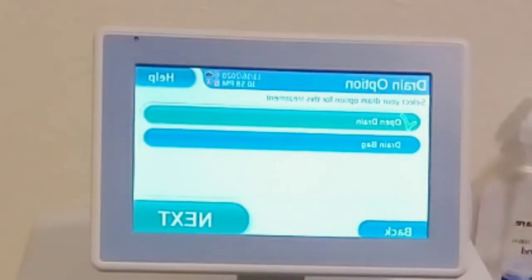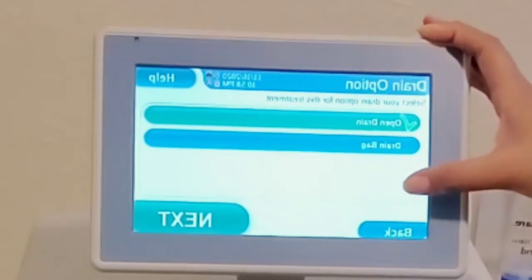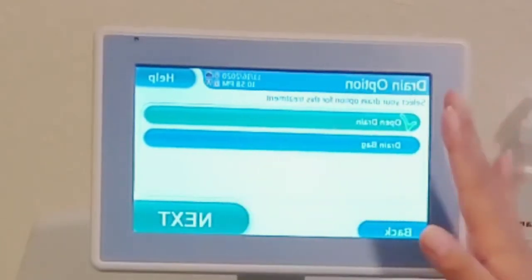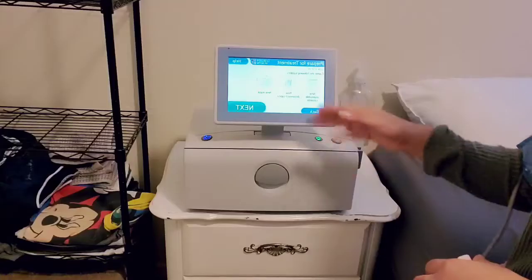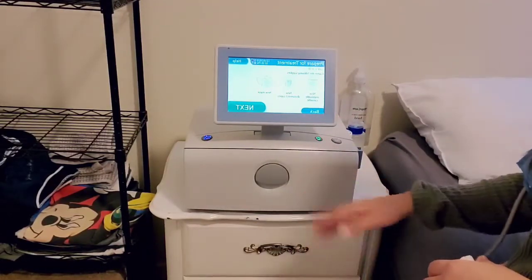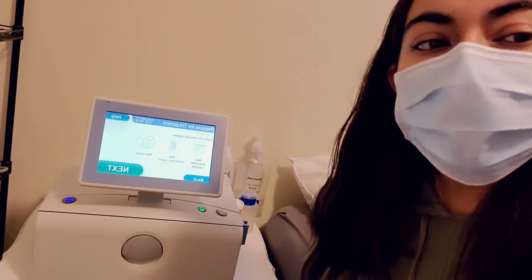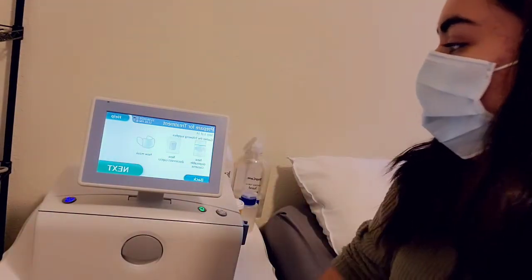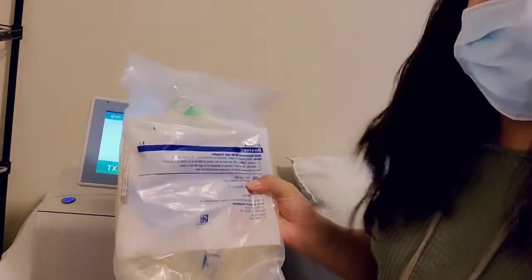This screen is asking for my drain option. I have it on open drain because I connect it to the toilet. You only use a drain bag when doing adequacy testing, which at my clinic is every three months — so not today. Open drain it is. Then it tells you which supplies you need: the cassette, new disconnect caps (which we have but won't need until morning), and a new mask.